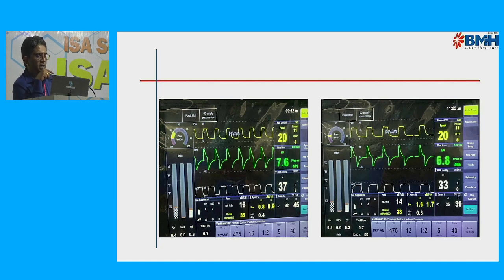Sana, if you are there, can you describe this? In this case, we noted a gradual increase in the ETCO2 value. Over here, we saw that the inspiratory FiCO2 was 8, that is, inspiratory CO2 was increasing.